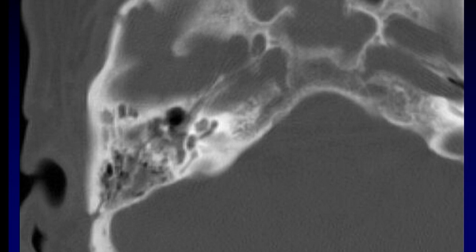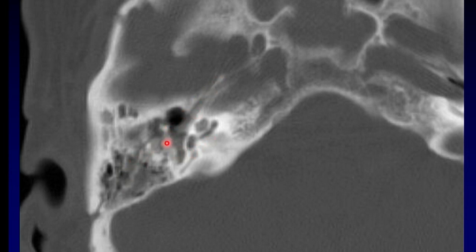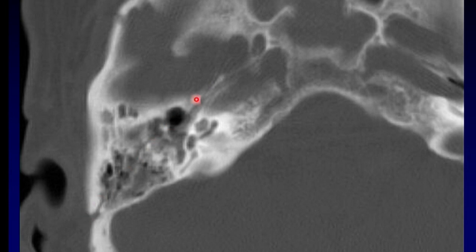Here's an example of a longitudinal fracture of the temporal bone. You can see that it is running right through the middle ear. In fact, the ice cream is off the cone — this is a malleoincudal dislocation as the longitudinal fracture runs through the middle ear.